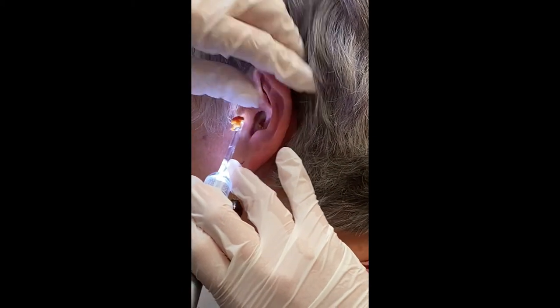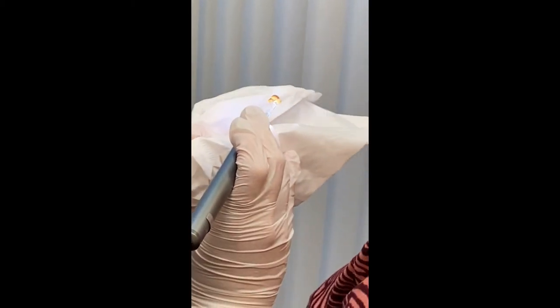Okay, do you wanna see it? Is it a big hunk? Oh my gosh.